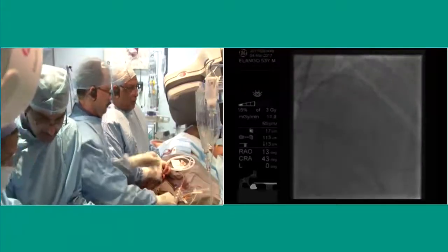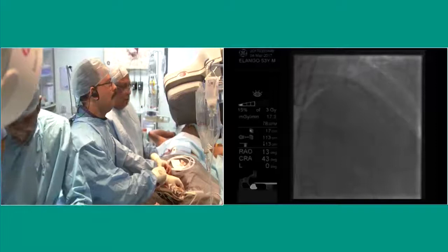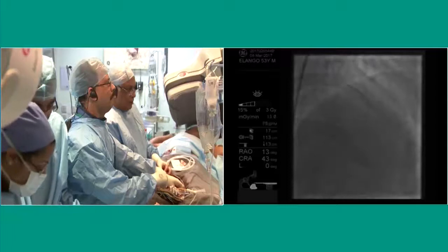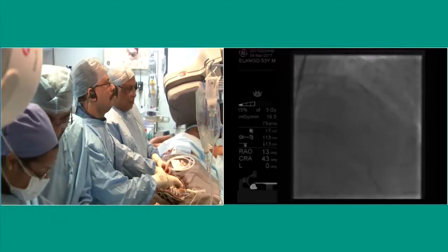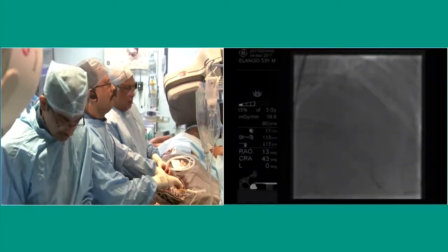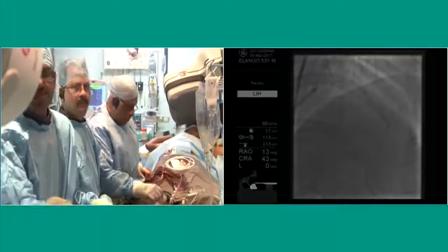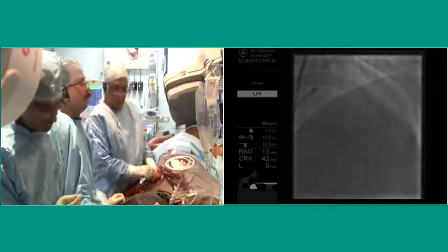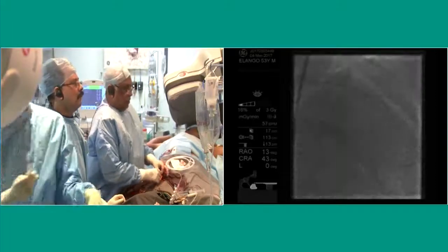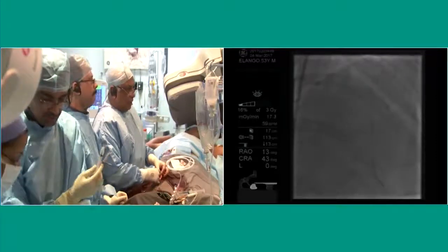See, when you were that side, we did do some work, and we did undo some of the work also. So you dilated the proximal lesion? That's right. We did a proximal dilatation using a 3mm NC balloon. Correct. Okay. Now we are taking the stent on the diagonal wire. And you wired the LAD. You dilated the proximal lesion and now the stent into the diagonal. So we'll just watch you do that before we stop the transmission.